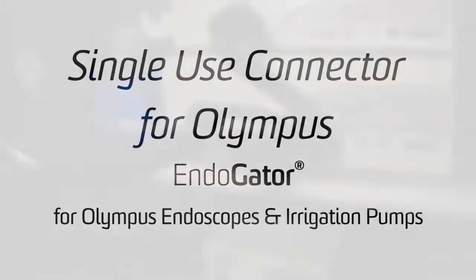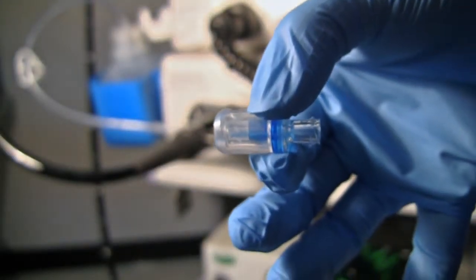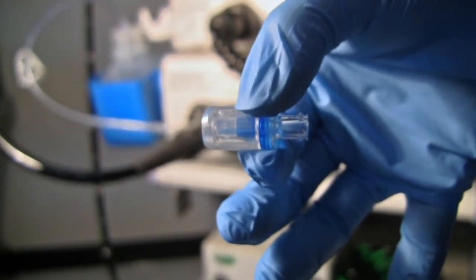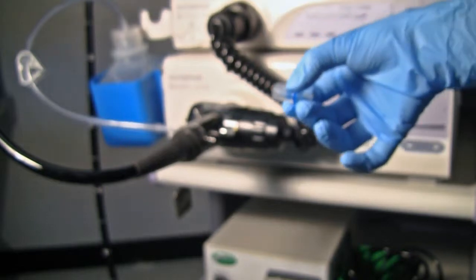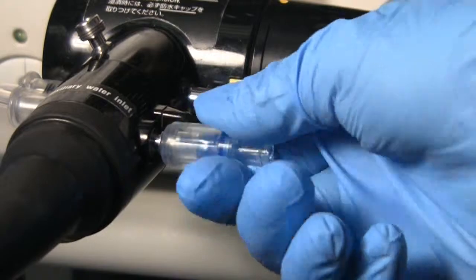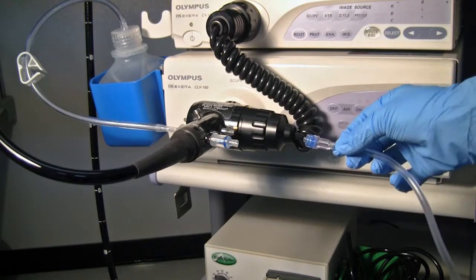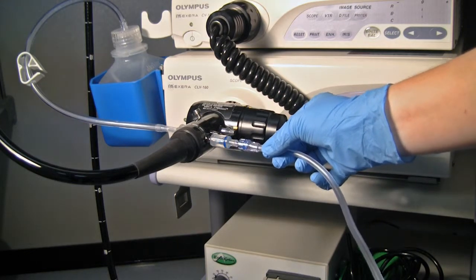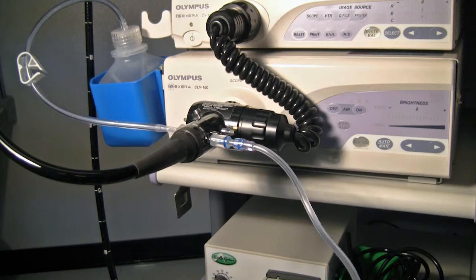Burn Medical also offers one of its universal connectors — a single-use auxiliary water port connector for Olympus scopes. Unlike the multi-use version, the single-use connector is made of various plastics and contains its own anti-reflux valve. Connecting to the scope is virtually identical to both the reusable and multi-use connectors. Attaching the endogator tubing is also the exact same, luer locking the endogator backflow valve to the single-use connector's valve. This creates a redundant backflow valve system, offering a second level of patient safety against potential cross-contamination.